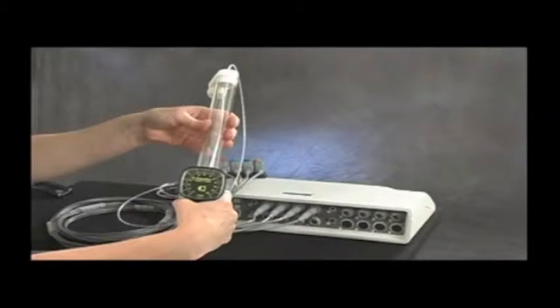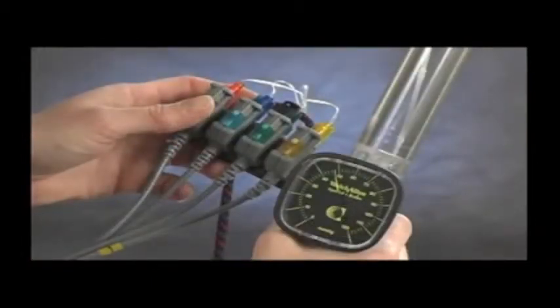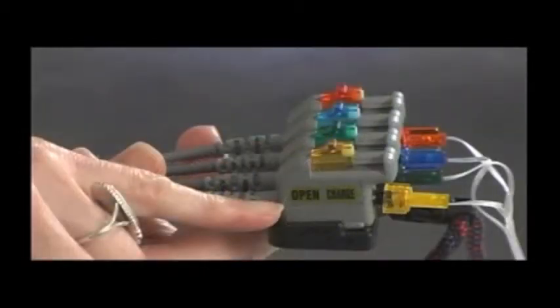Note that none of the 4 balloon sensors should be contacting the chamber wall when it is held in a vertical position. In the next step, we will activate the balloon sensors by charging them into an inflated state. This allows for a transduced pressure response by the sensors as they are being squeezed by GI tract muscles during the procedure. Important: before proceeding, recheck that the open charge switch is in the open position.